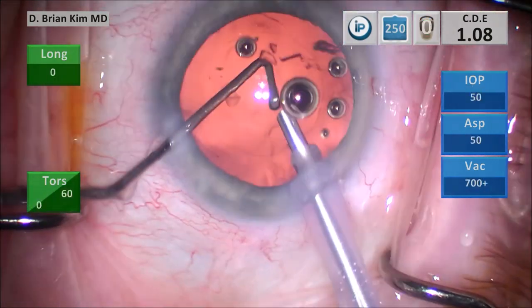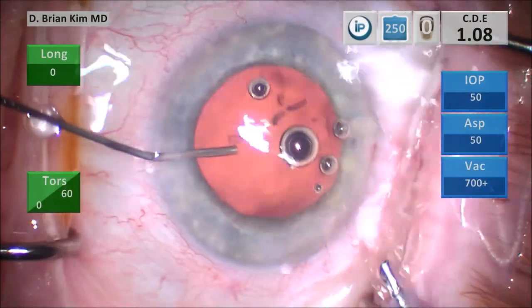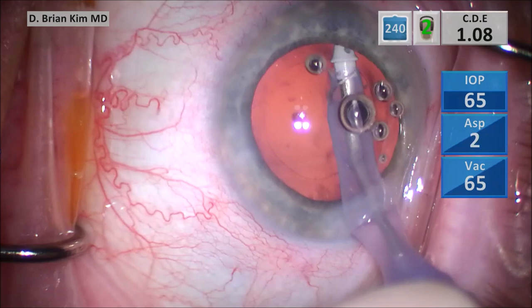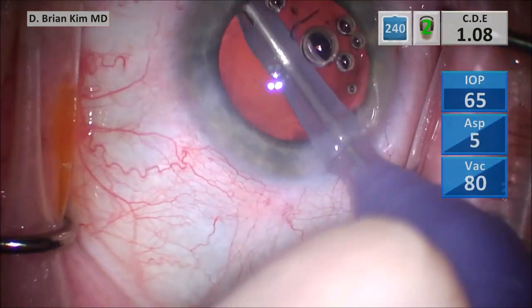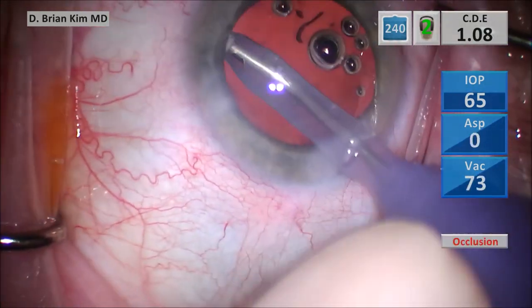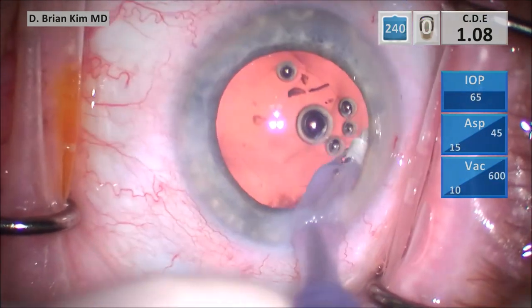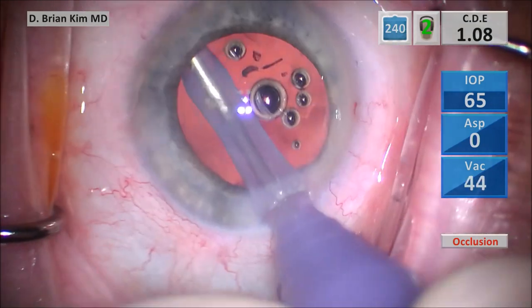Once all the epinucleus is removed, I take the chopper out, push BSS with the cannula, remove the phaco tip, and then switch it with the INA handpiece — this is my way to try to maintain some level of chamber stability. I'm starting to remove the cortical material on the cortex setting. I'm going underneath the anterior capsulorhexis sweeping side to side, but I'm using fairly low vacuum because I don't want to accidentally grab the capsular bag. You can see this is a fairly clean bag; I'm really going around just to be thorough. I'm also removing the lens epithelial cells.